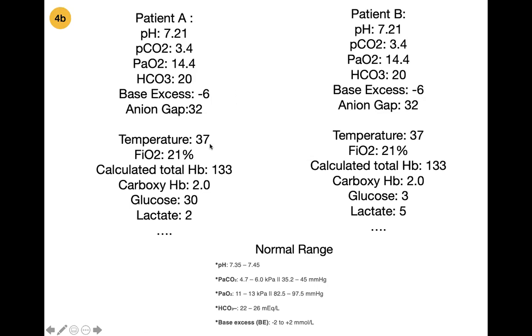Okay, so then we scroll down and we think, is there any extra information we can get from our ABG? Let's take patient A first. We've got a metabolic acidosis, we're scrolling down, and then we're seeing this glucose. That glucose is worrying. So then you say very worrying glucose, very high. What are we thinking? We're thinking this patient has diabetic ketoacidosis. Then we come on to treatment, how we manage that. These are two of the classics they might give you. Same again in the other one.